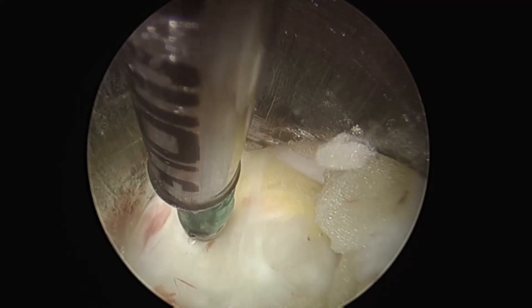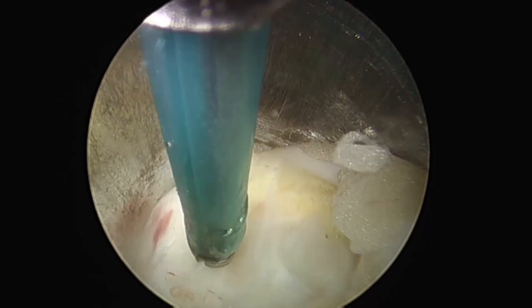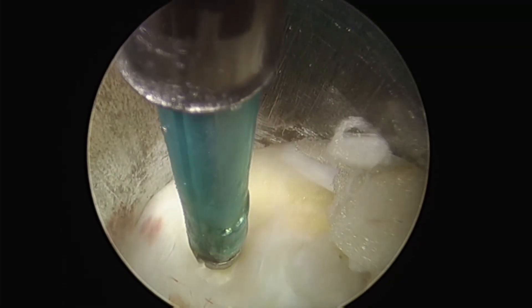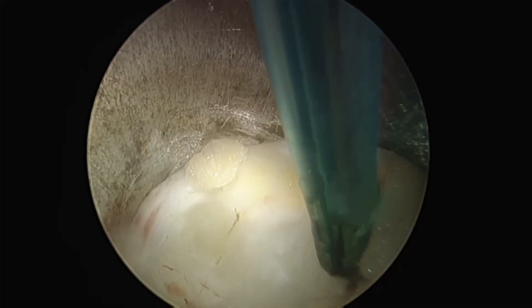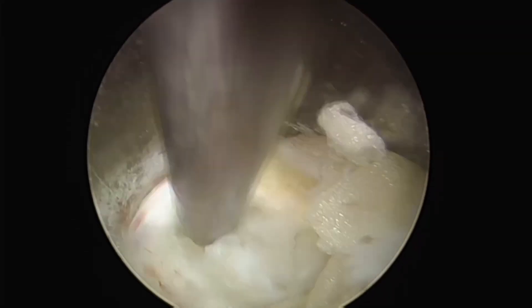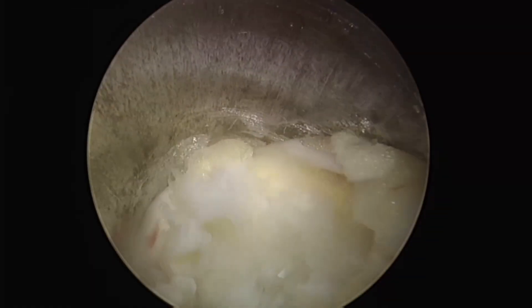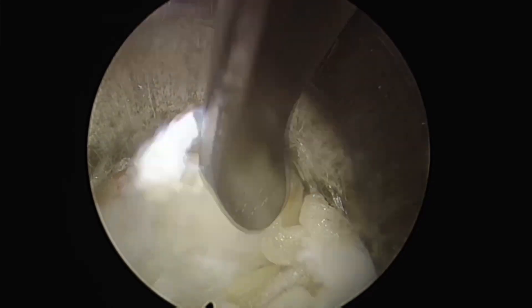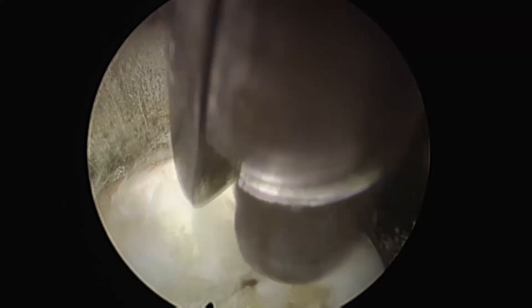Regarding disc removal, if the annulus fibrosus is intact, multiple holes are made with a bipolar, and the holes are enlarged with a basket punch. If the hole is too small, the disc herniation may not be removed in one piece, so I make an effort to create as large a hole as possible. The disc herniation is then removed in one piece.